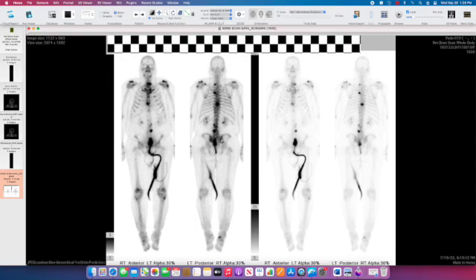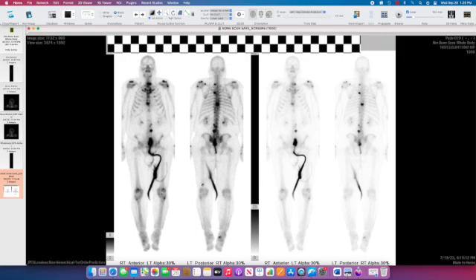You can have bone turnover related to degenerative disease, and that accounts for some of these other foci at the acromioclavicular joints, sternoclavicular joints, and near the patella at the knee joints — those are all likely degenerative. This tracer is also excreted in the urine, so it's normal to see some activity in the renal collecting systems and in the bladder.